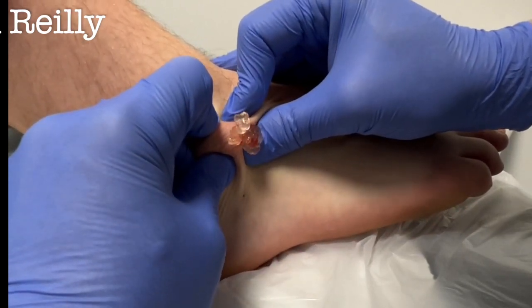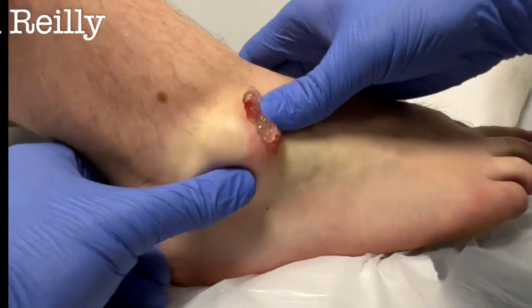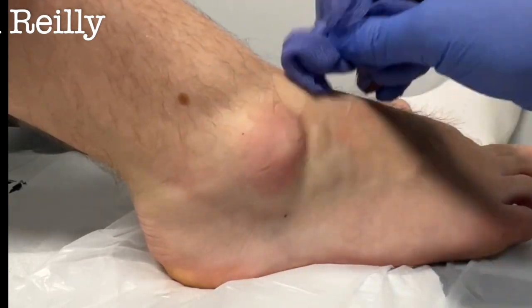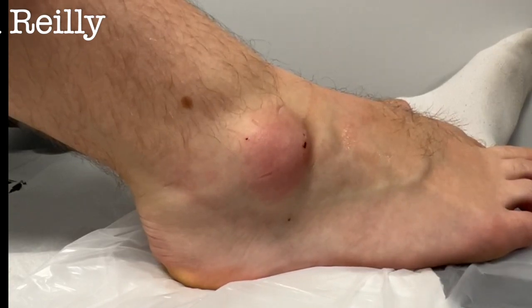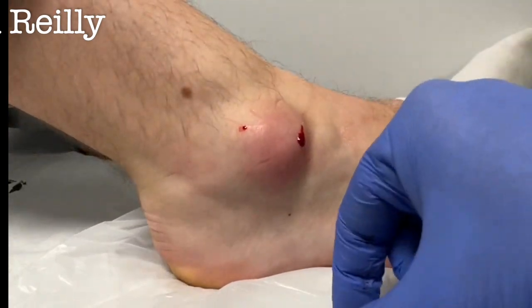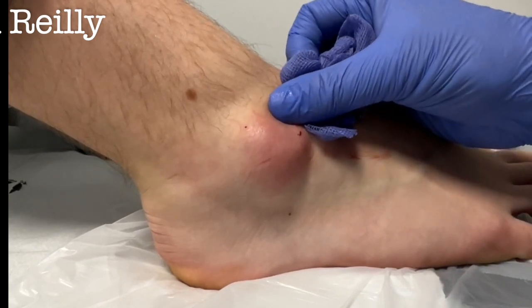It's how much of this we can get out. Very, very viscous. I'm thinking this is going to be one we're going to need to take to theatre just to take out the sack. If you can do a little bit of trauma to the sack, I get the odd one where I can really express all the fluid, do a bit of trauma to the sack, and it will sometimes kind of scar down. But this one's going to be a bit of a tinker — it's actually very, very thick and viscous, and I can see why it's been so sore.